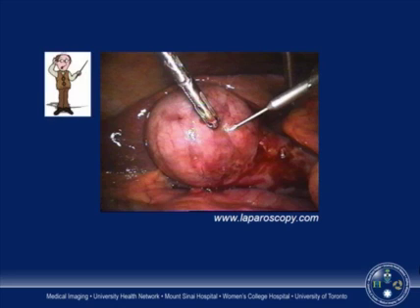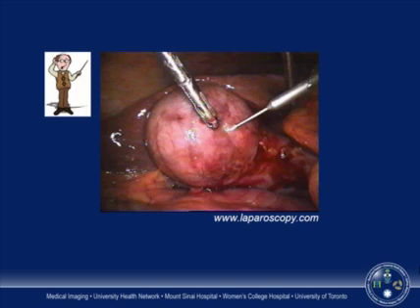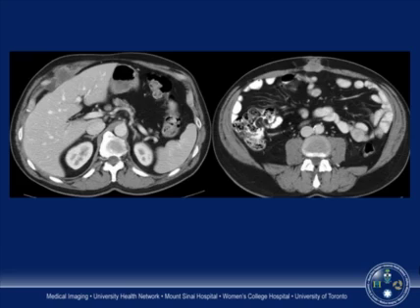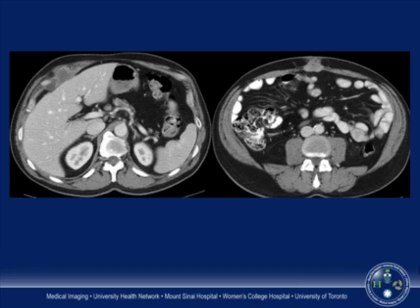Another teaching pearl: most gallbladders today are removed laparoscopically, and whether imaging in an acute or elective setting, we must always remember the possibility of underlying gallbladder cancer. Most surgeons feel better prepared if they are aware of this possibility before the gallbladder is removed through the laparoscopic ports, as there is a propensity for gallbladder cancer to recur at the laparoscopic port sites if proper precautions are not taken. Here's an example: three months post elective cholecystectomy with an underlying unsuspected gallbladder cancer showing recurrence at the right upper quadrant and umbilical port sites.